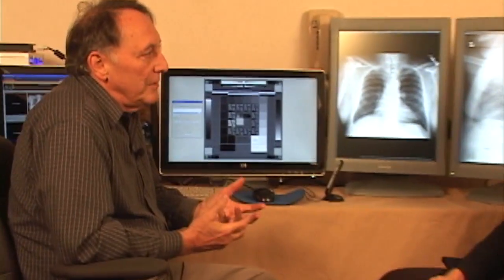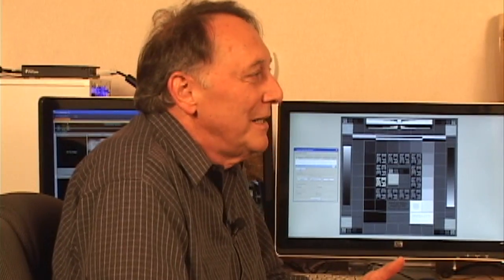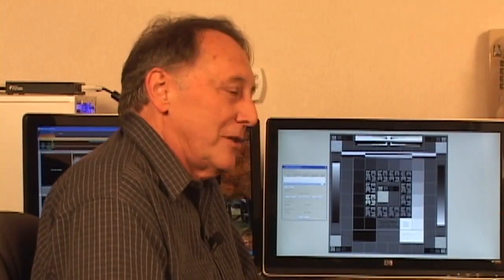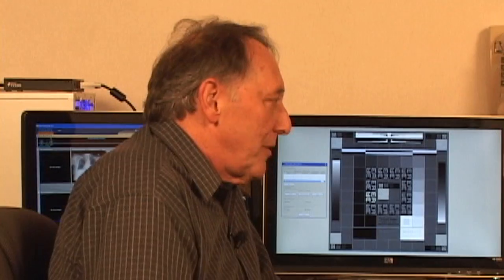The lifetime of the monitor in terms of the luminance level, which is what you're looking at for a specific set point for calibration, you have to look at what the original specifications for it are. As a hardware person from my background, we looked at the lamp sources and they rated them at 50,000 hours of their half-life. So if you drove them at 100% of their rated drive voltage and just let them deteriorate over time, which is roughly 10% the first few thousand hours, then it slows down quite a bit. You can average normally 3 to 5 years out of these displays easily. It really depends on how you use them in your facility.